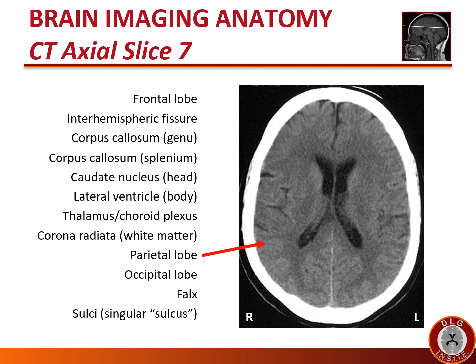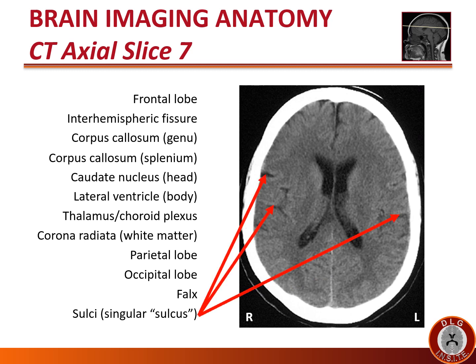The area of cerebral cortex posterior to the central sulcus is the parietal lobe. This slice is still inferior enough to see the occipital lobe posteriorly. The white or hyperdense line separating the two cerebral hemispheres is part of the dura called the falx. On a CT, the black or hypodense CSF-filled wrinkles in the cerebral cortex are called sulci, or individually a sulcus.